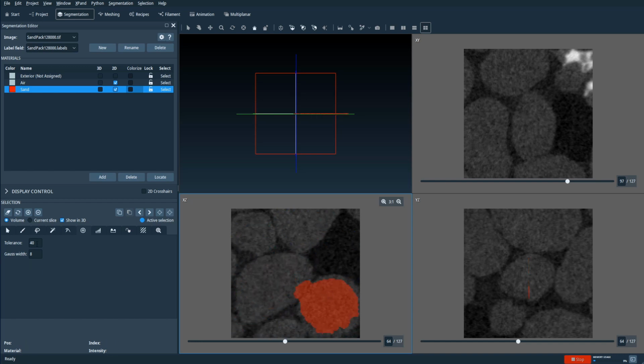Even if we set this to, let's say, 30, the region is still growing pretty fast. But if we lower this value to, let's say, 1, the region grows much slower, because under the hood, the image is not smoothed out as much.